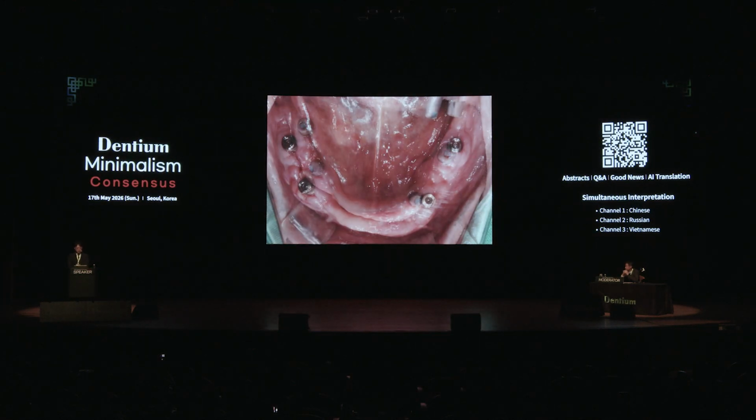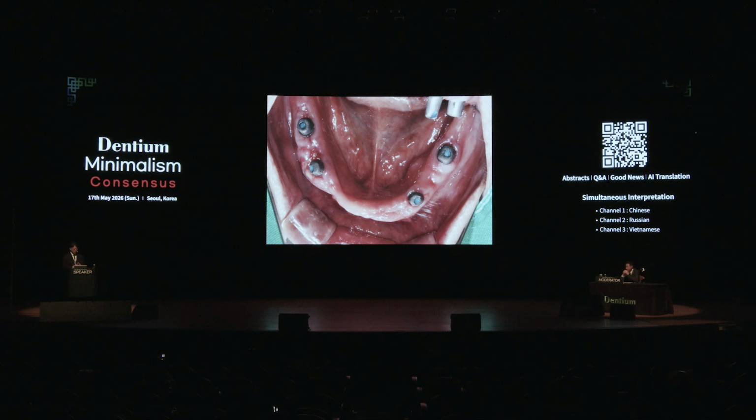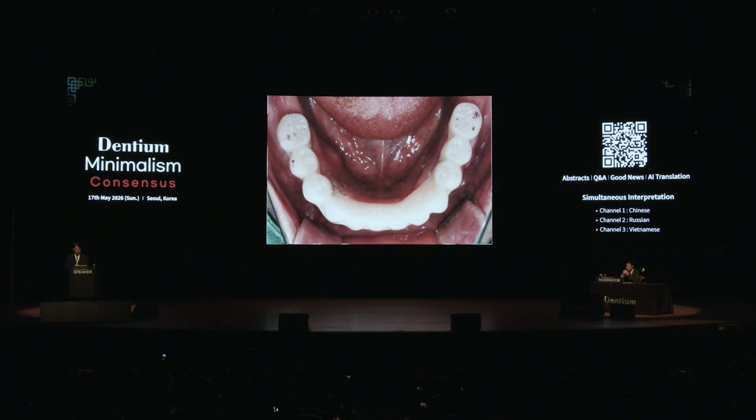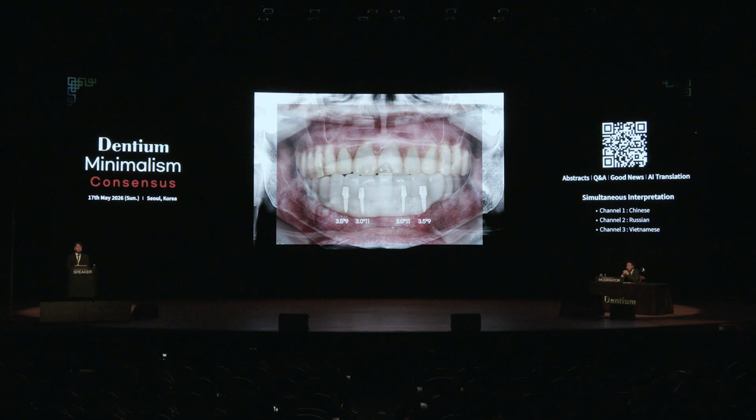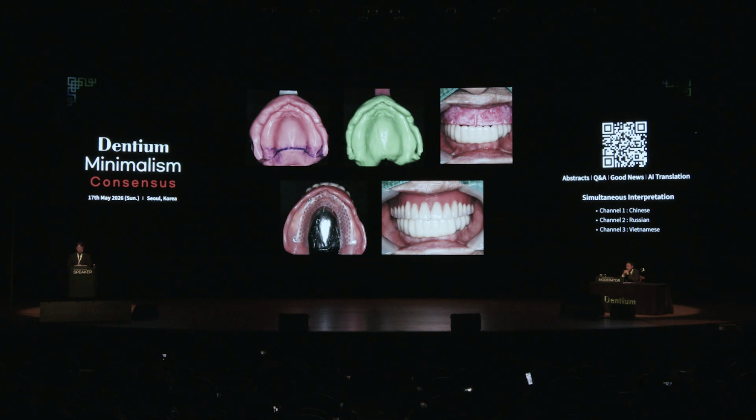The custom abutment and newly fabricated provisional restoration have been delivered in the mandible. Even without any occlusal adjustment, we can see that the occlusal contact points are relatively stable. As you can see, the provisional was delivered on the day of stitch removal, so the gingiva has not fully healed yet. At this stage, the patient eats better and feels much more satisfied. While waiting for implant osseointegration, we made the maxillary complete denture in a conventional way.